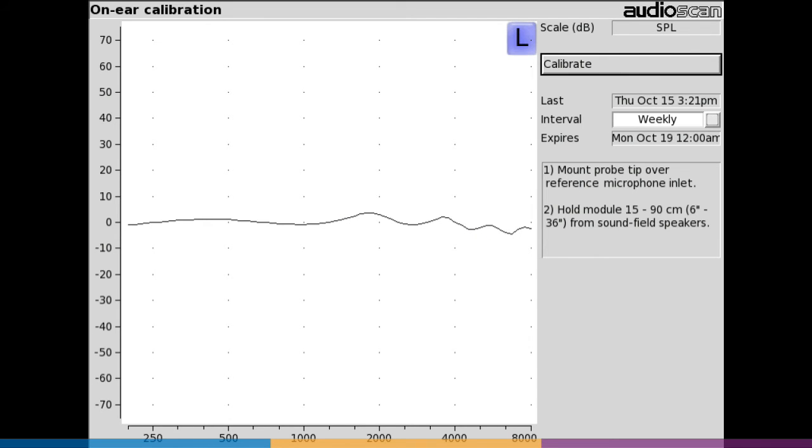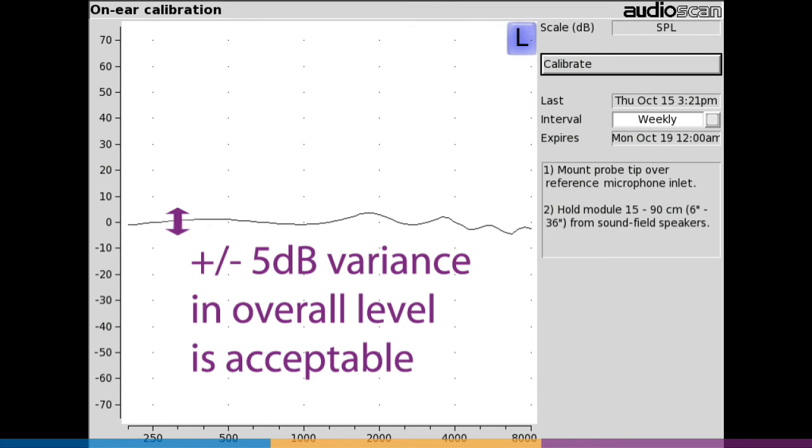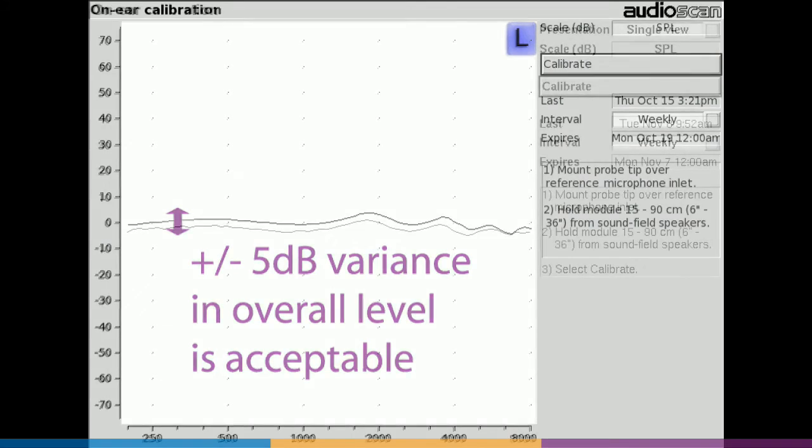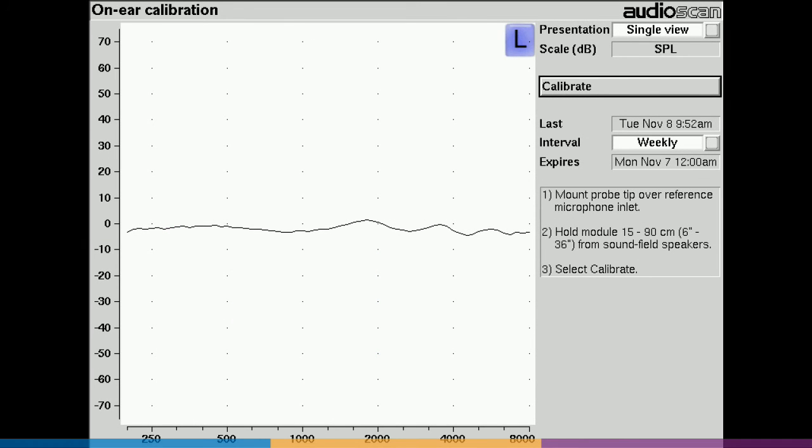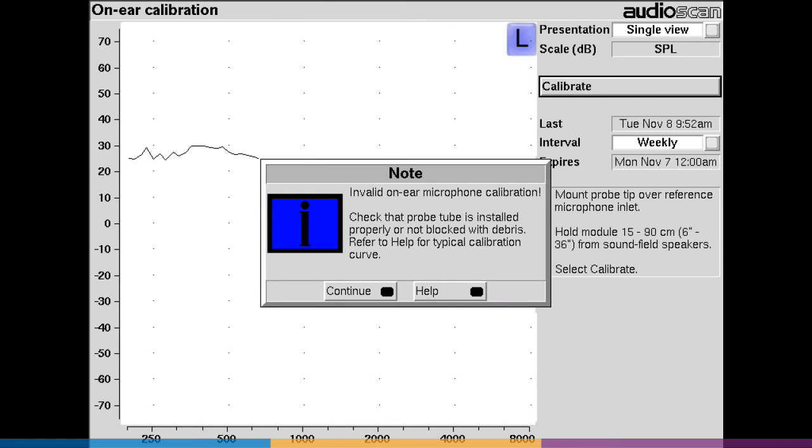The calibration curve should be relatively smooth with gentle undulations in the high frequencies due to tube resonance. Overall level is not important and may vary from microphone to microphone, but typically only plus or minus 5dB. AudioScan's new smart calibration monitors for improper curves and will flag errors and warn the user.